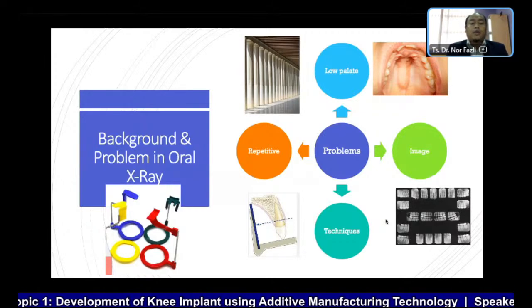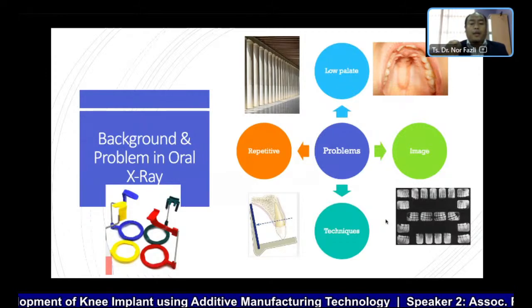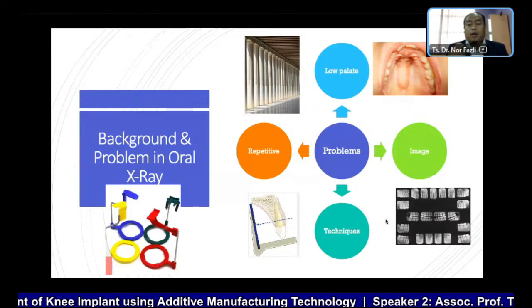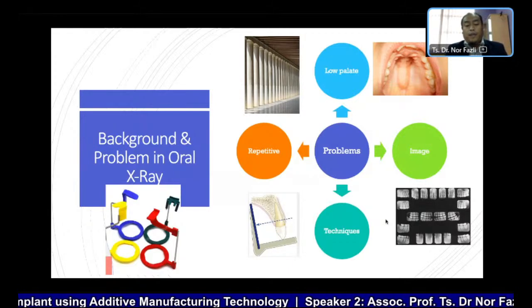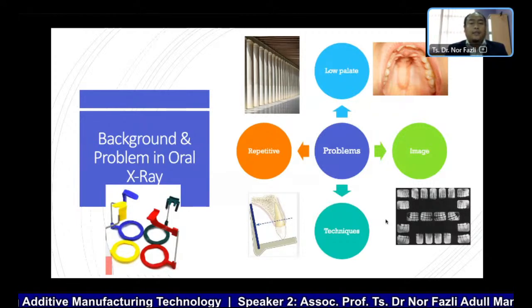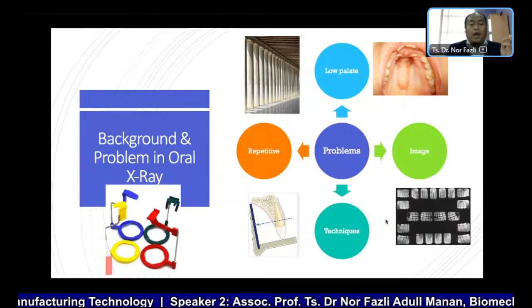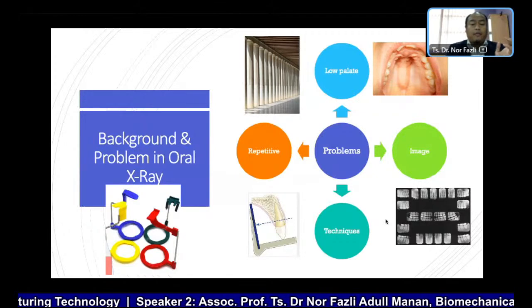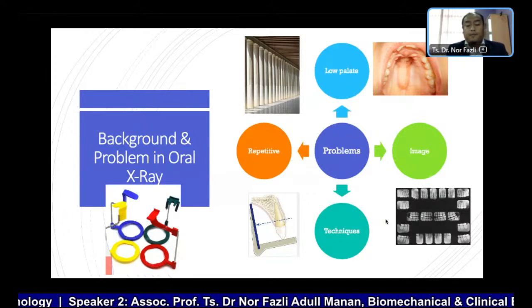This Rinn holder is a medical device used to perform an X-ray of your teeth. The colors on the Rinn holder each have a specific function, for example for the right side, left side, or the middle from the front.